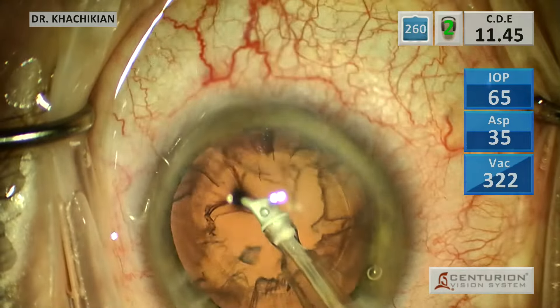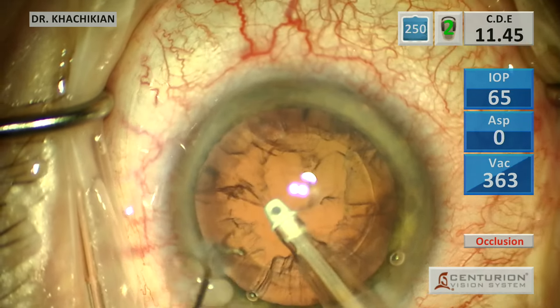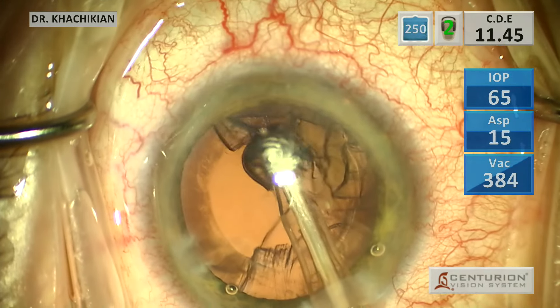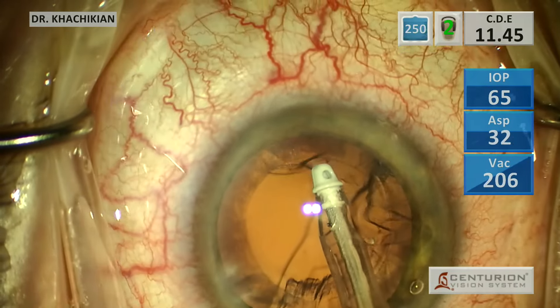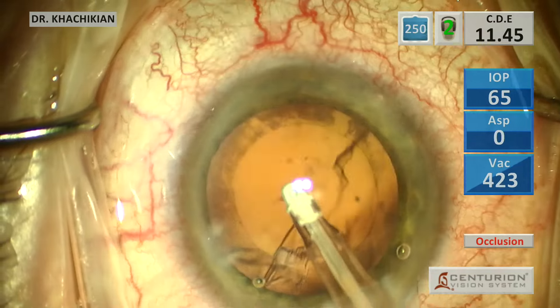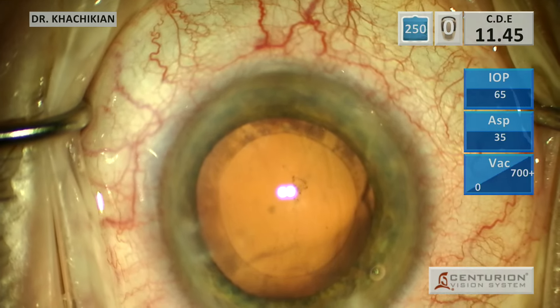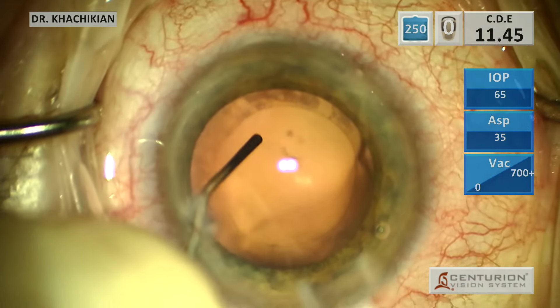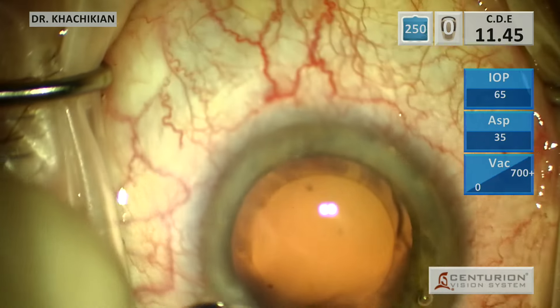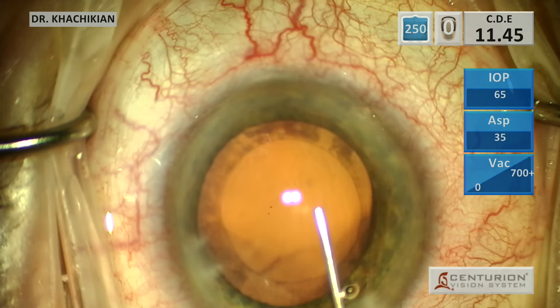With this kind of consistency of a lens, you want to make sure there are no nuclear chips floating around. Sometimes when it's a little bit more of a brittle lens like that, those nuclear chips will kind of shoot all over the AC. You can get a little bit behind the iris, and so sometimes you want to irrigate fluid back there just to be sure that there are no pieces hiding. We get the remainder of our cortex here, and then you can see there's a little PCO there — we can kind of power wash that away. We'll also use that to look for nuclear chips, but potentially sometimes they'll come out when you're irrigating. There's a little retained visco laterally there, but that's okay.